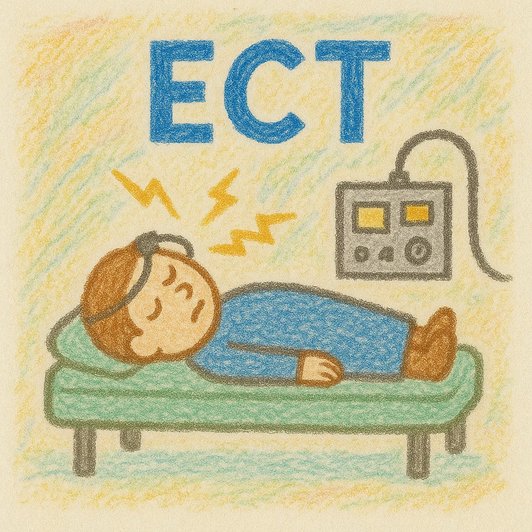You then establish that the impedance on the device, which is a measure of resistance, is sufficiently low. And then you can administer this electrical stimulus. It will hopefully induce a seizure, which you can see by movement of their body and also from the EEG recording itself. The seizure typically terminates within a few seconds to a minute.